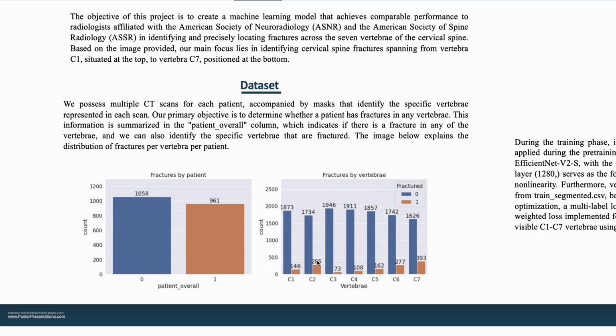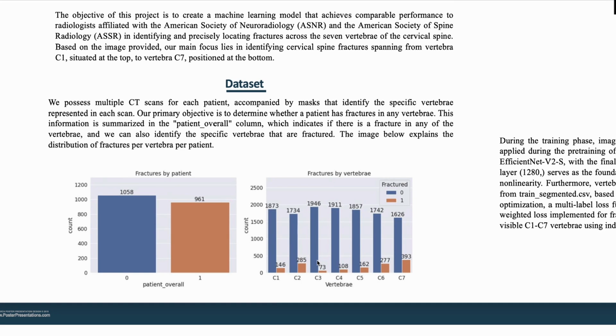It's not biased towards any specific vertebrae section, and this makes it easier to know that our results can be pretty accurate and not really flawed, because if C2 had only about 500, while C7 had about 20,000, we would know that it would not be able to accurately predict the results if a C3 section is given. So now we know that we have a pretty balanced data set, and this is what we're working with.